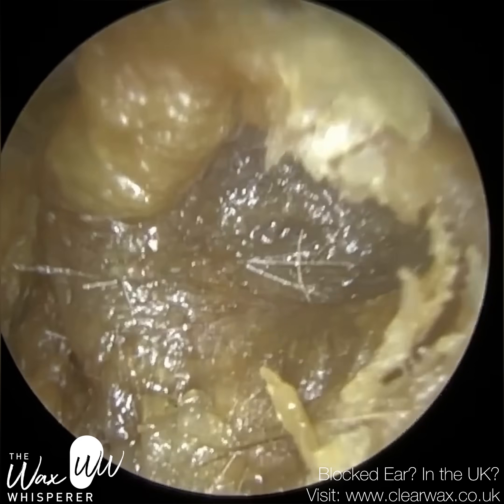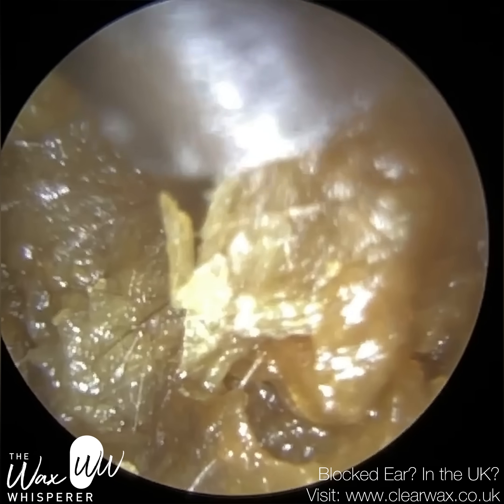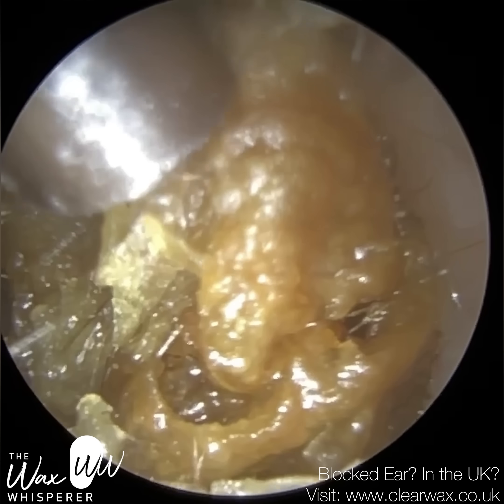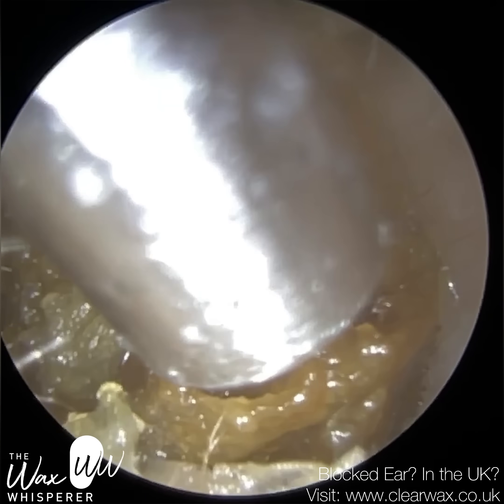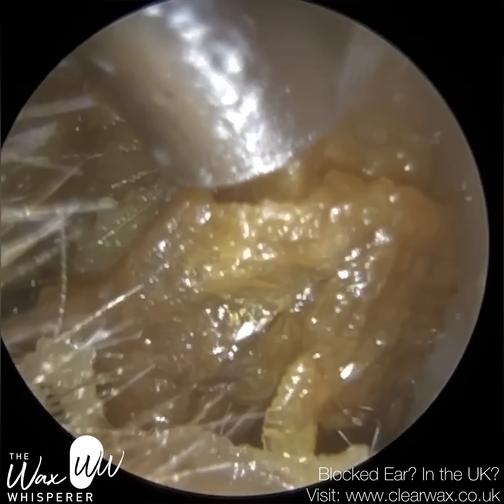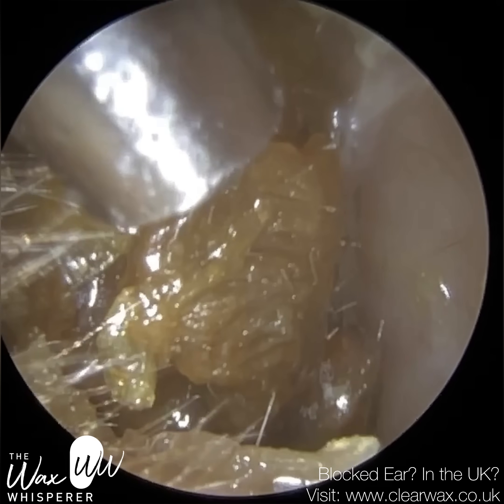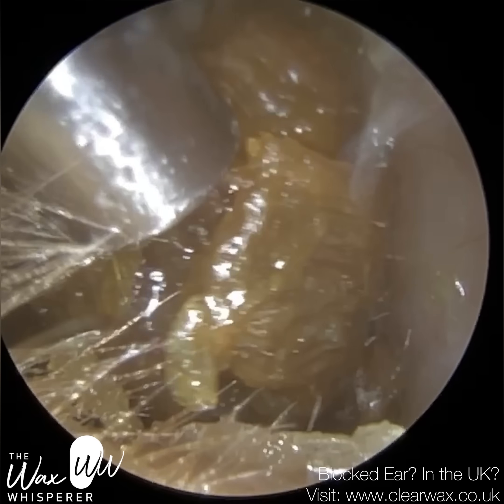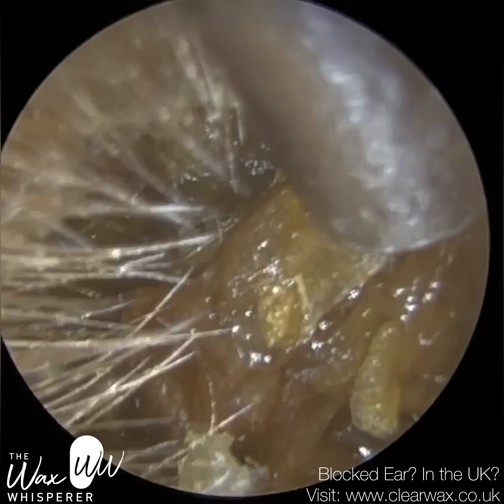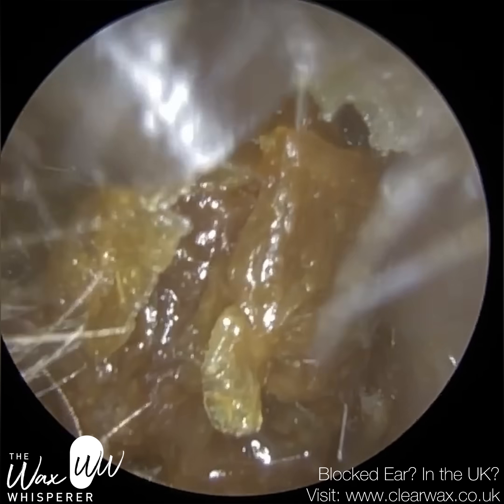The ear canal and the outermost layer of the eardrum is lined with a layer of skin called the epidermis. As this skin dies and replaces itself, the old skin should naturally migrate out of the ear whilst it's shedding until it eventually vacates the ear. But in cases of keratosis obturans, this dead skin — keratin — fails to migrate out of the ear and instead forms into a plug just like this.